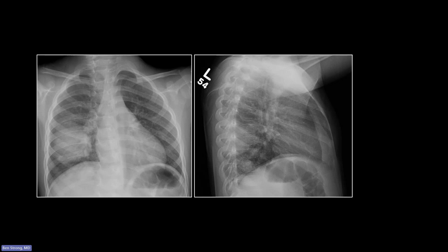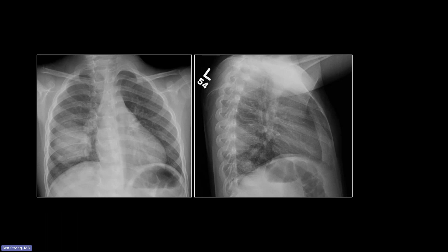This is a great case and always a fooler — nice to be introduced to it. Looking at it straight on, you would say that could easily be a mass, and it'll freak you out the first time. But if you look really closely, the edges are not well circumscribed. On the lateral, it appears to conform to the superior segment of the right lower lobe, with a more wedge shape and clearly defined superior and inferior borders.